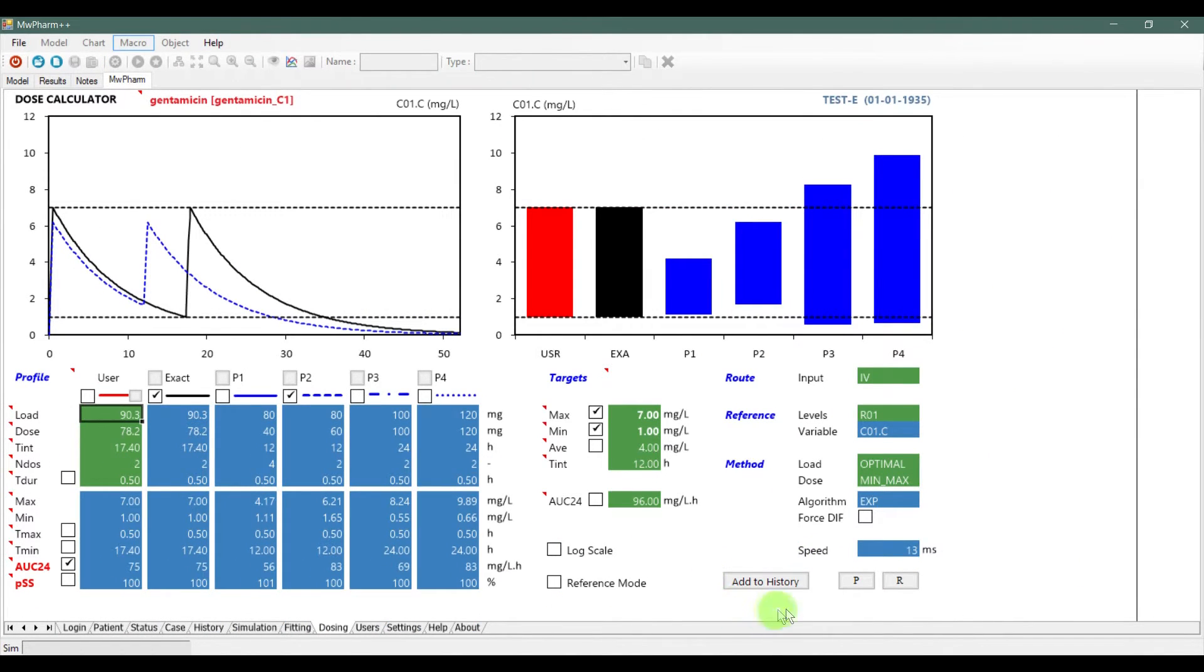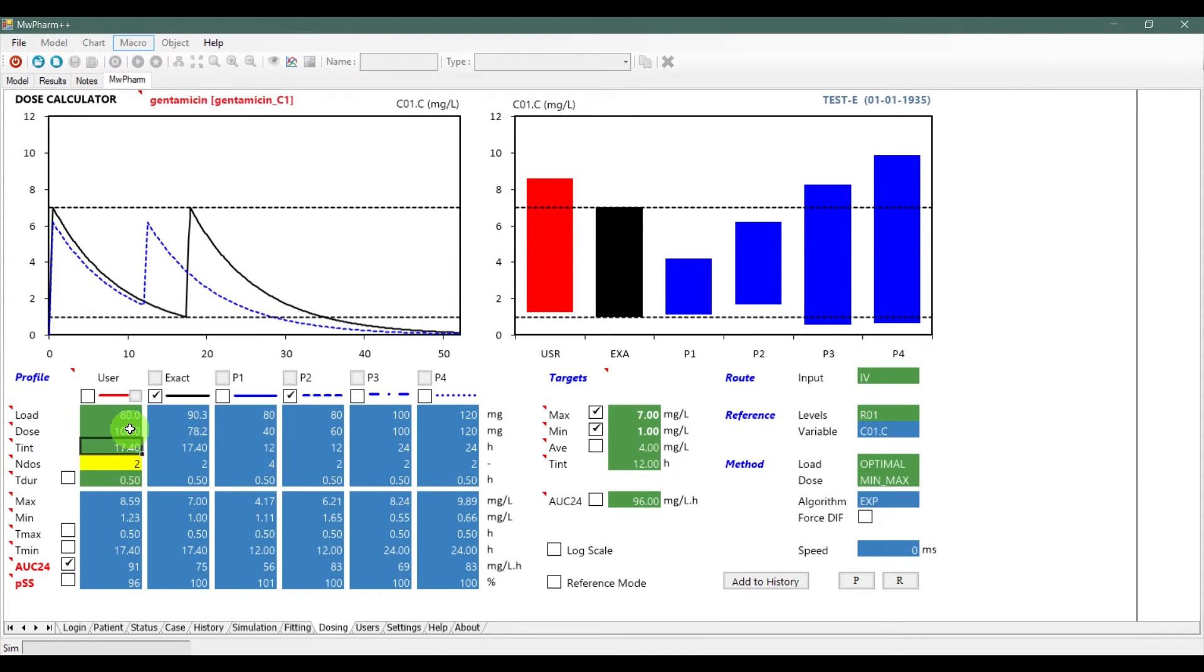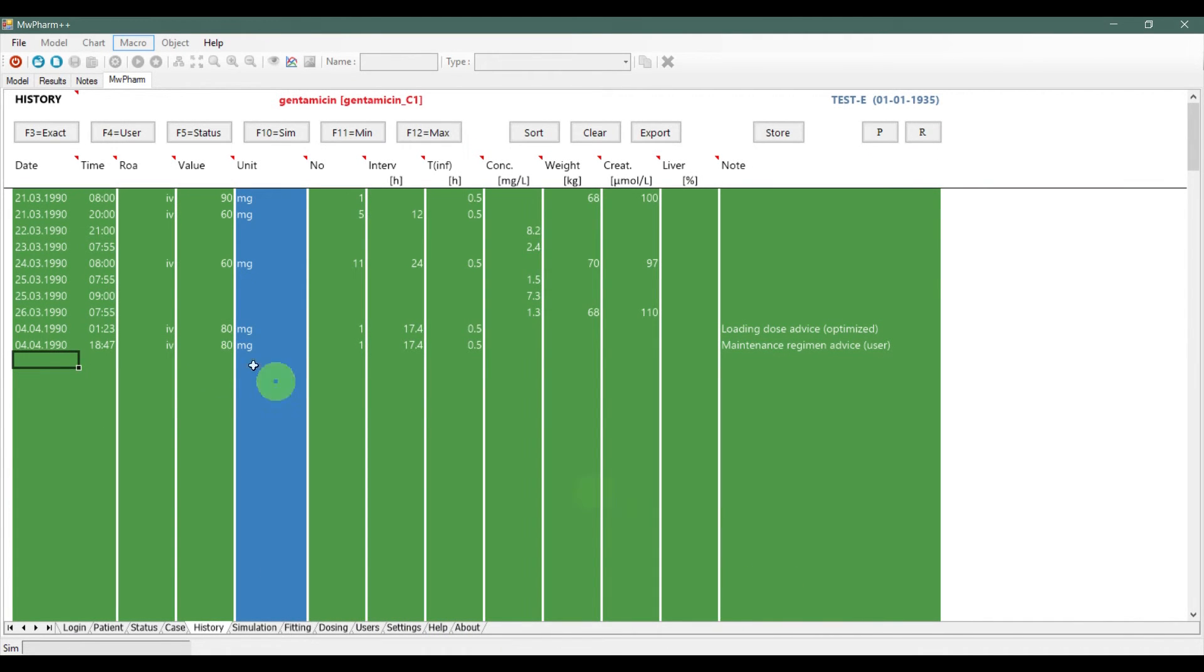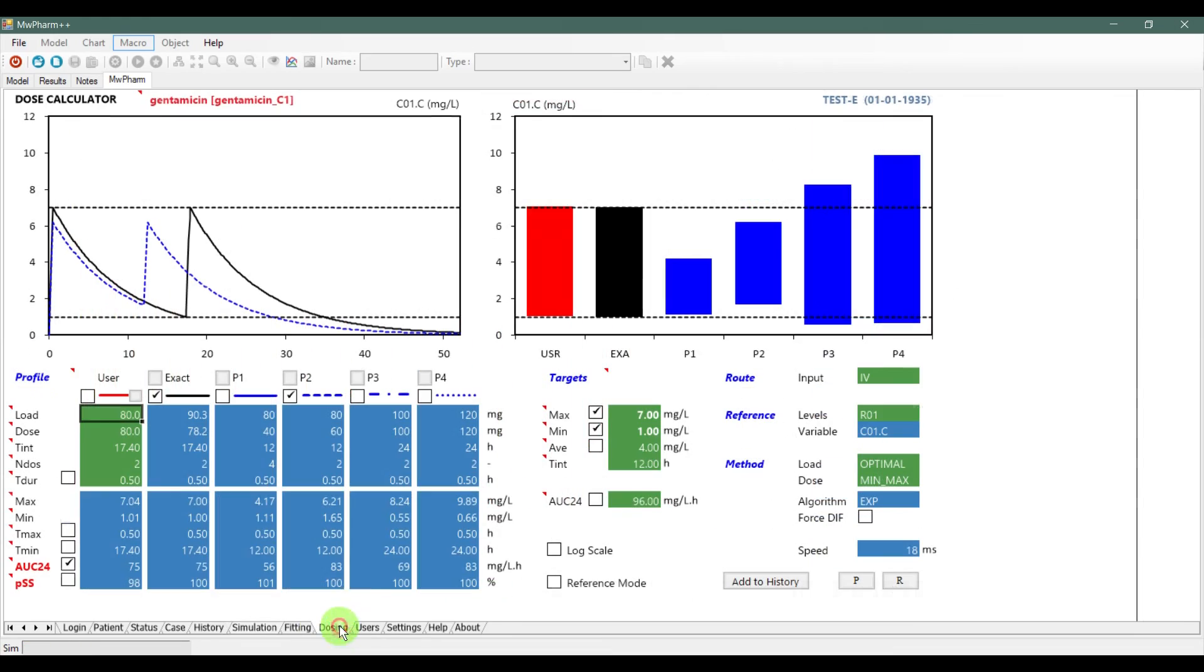If you click the button Add to History, your dosage that you insert here will be reflected in the History tab. This function calculates the exact dosage and period between doses, so that the concentration is again between the desired maximum and minimum values. This function is useful in case you have an overdosed patient. You do not need to figure out how much to reduce the dose, because you will know the new dose immediately.